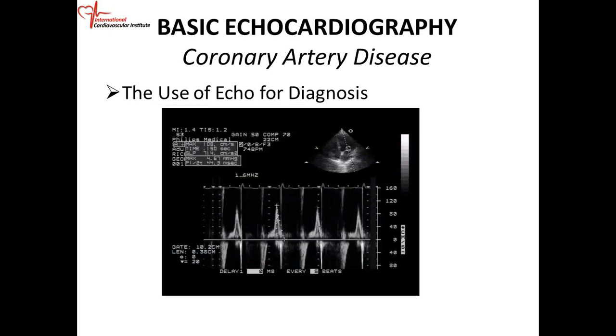All right. And then when you look at your mitral inflow, you may see evidence of elevated left ventricular filling pressures. We talk about your E/E prime. So if your E/E prime, the medial, is greater than 15, it suggests elevated left ventricular filling pressures, which is one of the features of heart failure. All right.